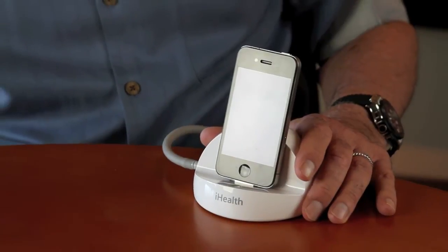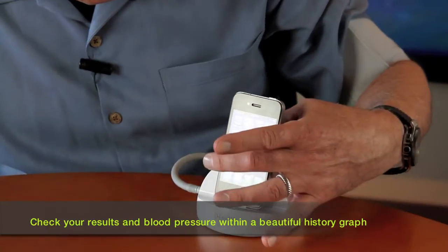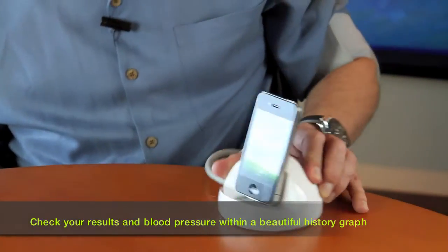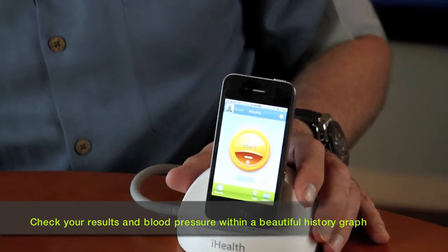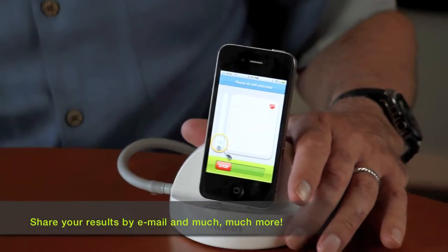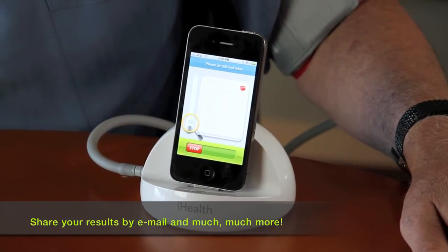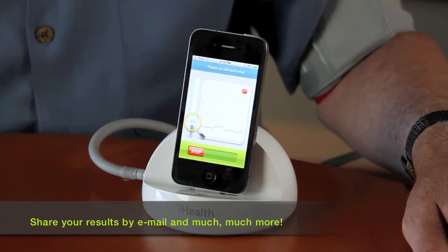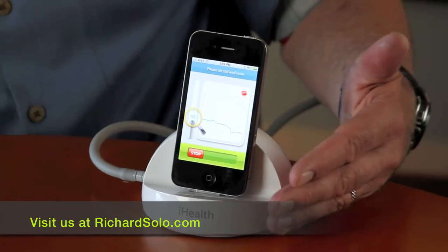What's cool about this product, in addition to the fact that it's a colorful, fun readout, is that it gives you the history recorded at the iHealth app site. So not only are you taking your blood pressure, but you're also keeping a graphic history. You can email the results to your doctor. It's just fully featured — go to our website and click on the product page at richardsolo.com to see all the benefits and features.